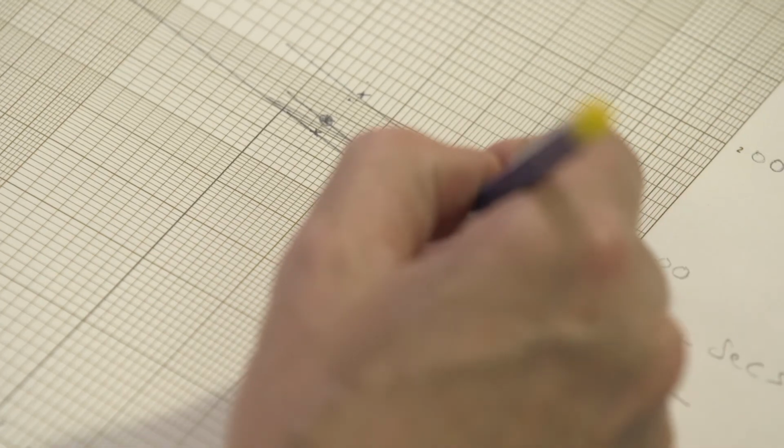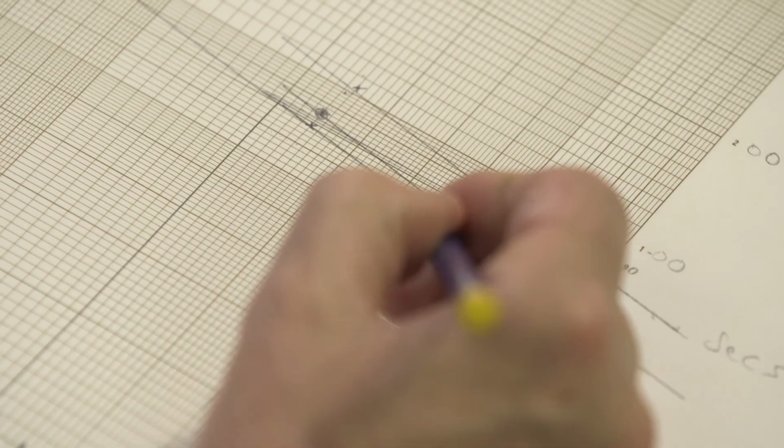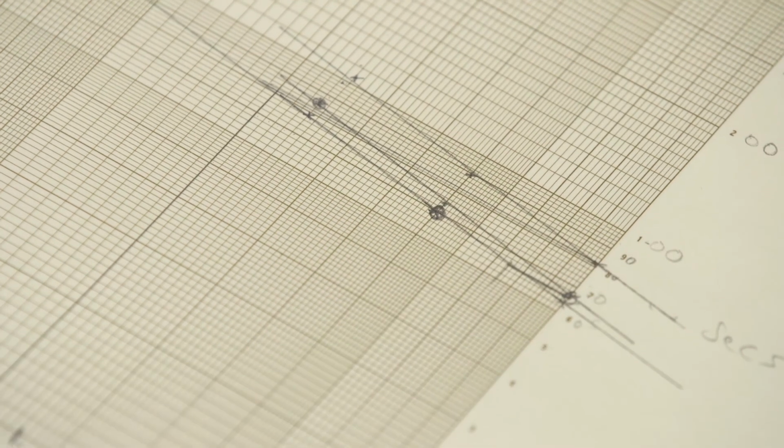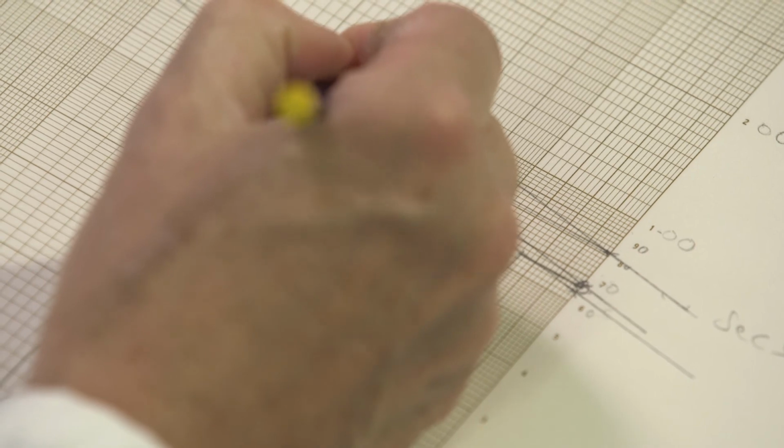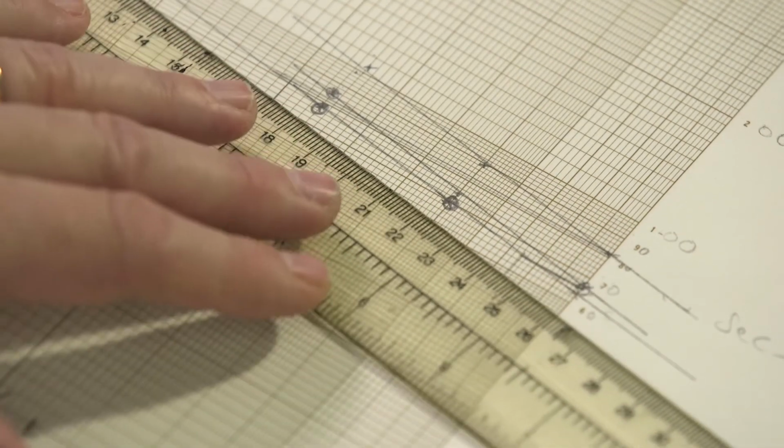Next patient, 1 in 10 dilution, 67 seconds. 1 in 20 dilution, 70 seconds. Here. 1 in 40 dilution, 78 seconds. Here. So now we have 3 points.